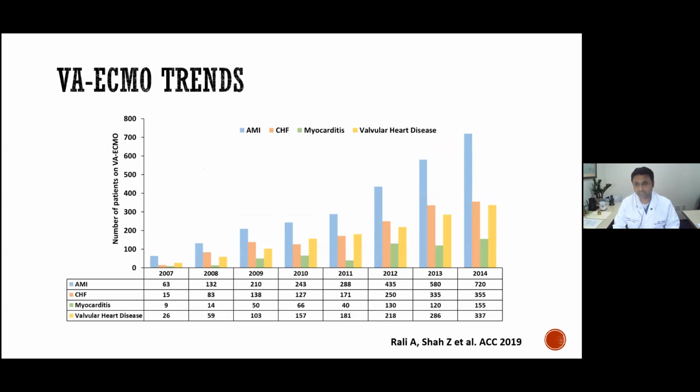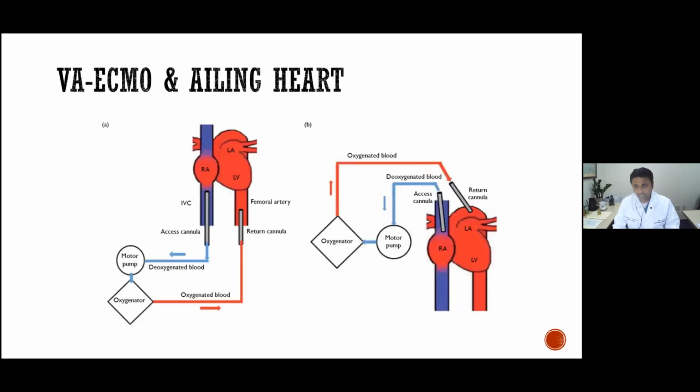Furthermore, given the findings of the CHEER trial from 2014 and the ARREST trial from 2020, ECMO is also now globally being used more frequently during cardiopulmonary resuscitation, this concept of ECPR as we have come to know it. So VA ECMO, as we know, there are several components to this circuit, and most of us on this call are very familiar with the various components that go into this circuit.